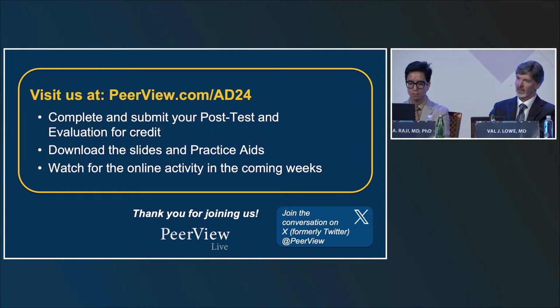And you want to make sure that if you can make that comparison visually, I mean, you can do this quantitatively, if that visual comparison is about the same, you can be comfortable that the activity you're focusing on in the gray matter is probably just a normal amount of activity. It's always going to be a little bit blurred, and so that's tough. I think the other thing to do is to page through the images and see if there are similar findings on different axial views.